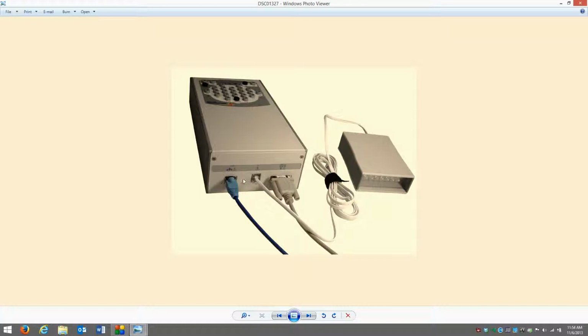The amplifier has three connections. The first one is RJ45, which is for the LAN cable that connects directly to the computer, whether it is a laptop or a desktop. We then have the RJ10 cable, which connects from the amplifier to the photic, and then the power supply cable, which is a DB9 connector. Everything connects directly to the amplifier.